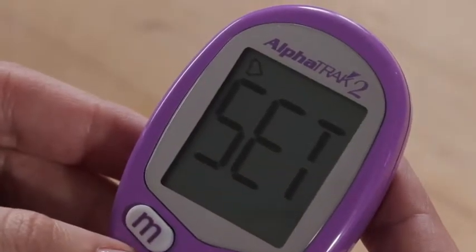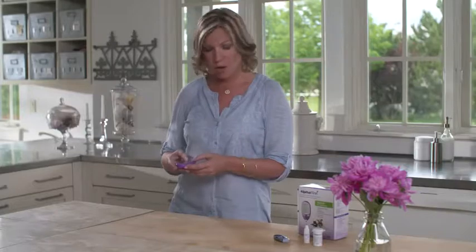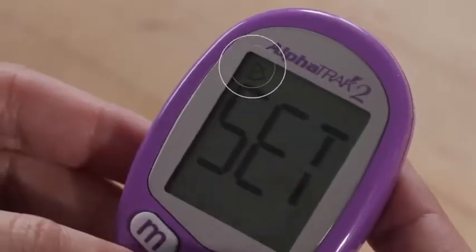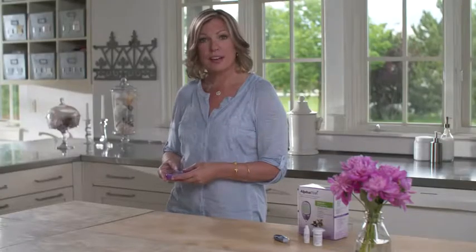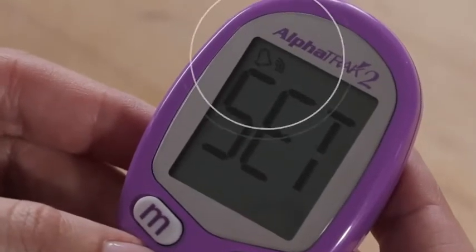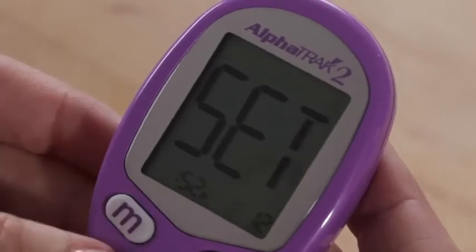To set the sound, press the C button. For no sound, press the C button again until you see this. For a low beep, press until you see this. And for a louder beep, press the C button until you see this. Once you have selected a volume, press the M button to save.